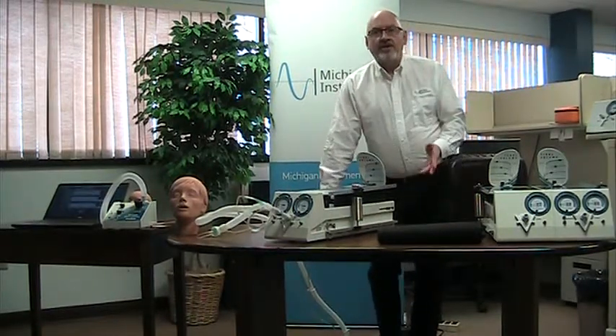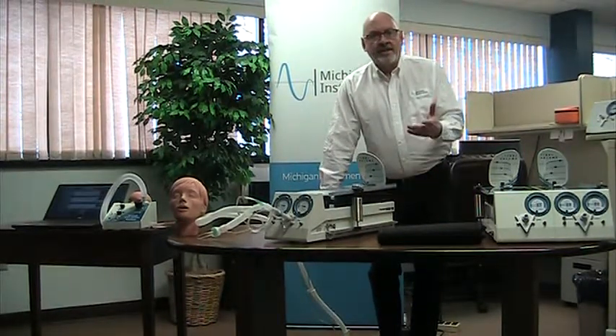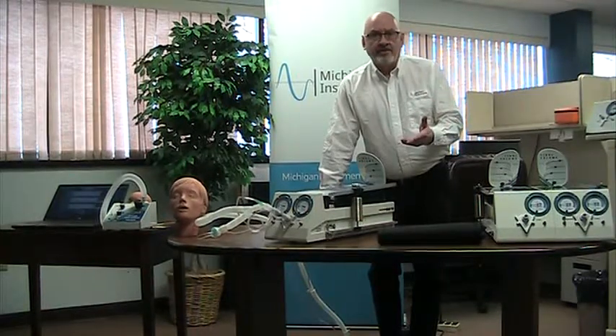Hi there. Today I want to talk about some of the basic functionality of the different lung simulators for Michigan Instruments.